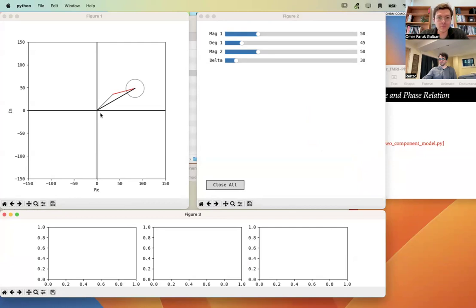At this point, there is the complex valued voxel. So we have one real number recorded, one imaginary number after Fourier transform. So a voxel is represented by two numbers. What we look at by default is the magnitude of that voxel. That's our traditional magnitude fMRI time series.